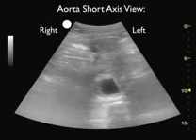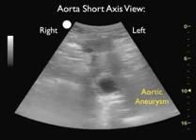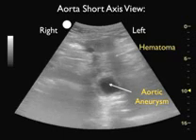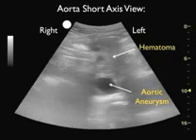Here's a rare video case of a patient who presented with acute abdominal pain, and on palpation of his abdomen I thought I could feel a pulsatile mass. So I brought the ultrasound machine to the bedside and took a look.